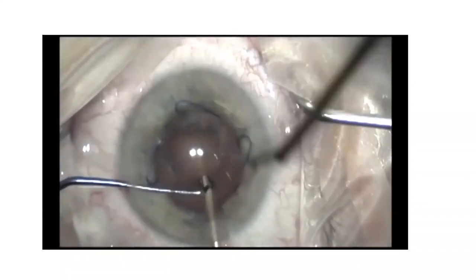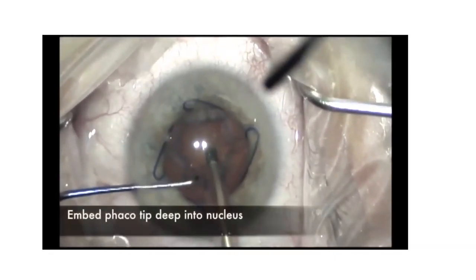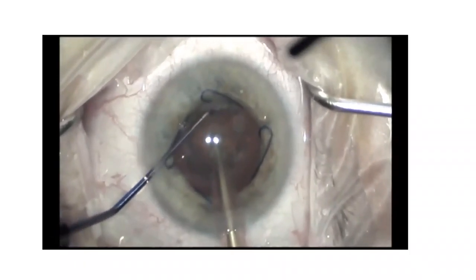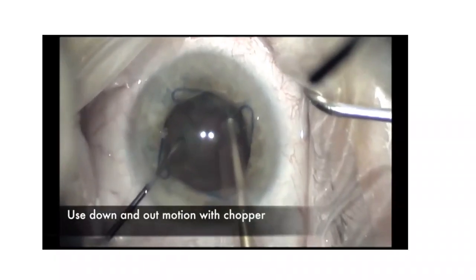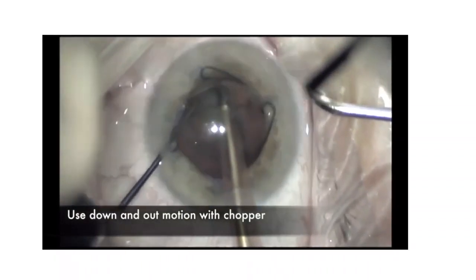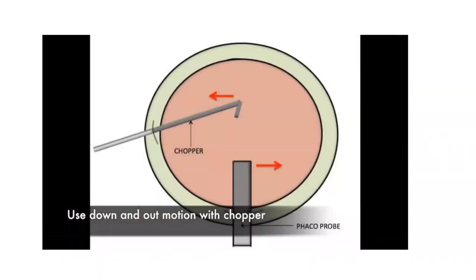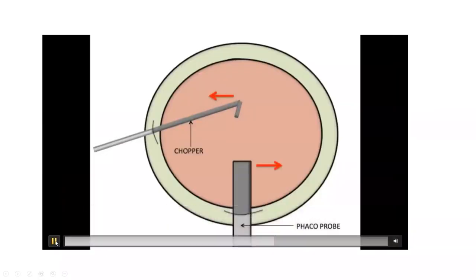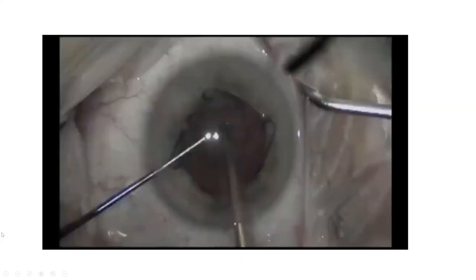The patient here has a small pupil. We are using a pupil dilator ring. That's why we are not able to go to the equator. So we just embed the chopper in front of the nucleus, then lateral separation will cause cracking. So here you see, you are just embedding the chopper within the nucleus. Then after embedding, lateral separation will cause cracking.